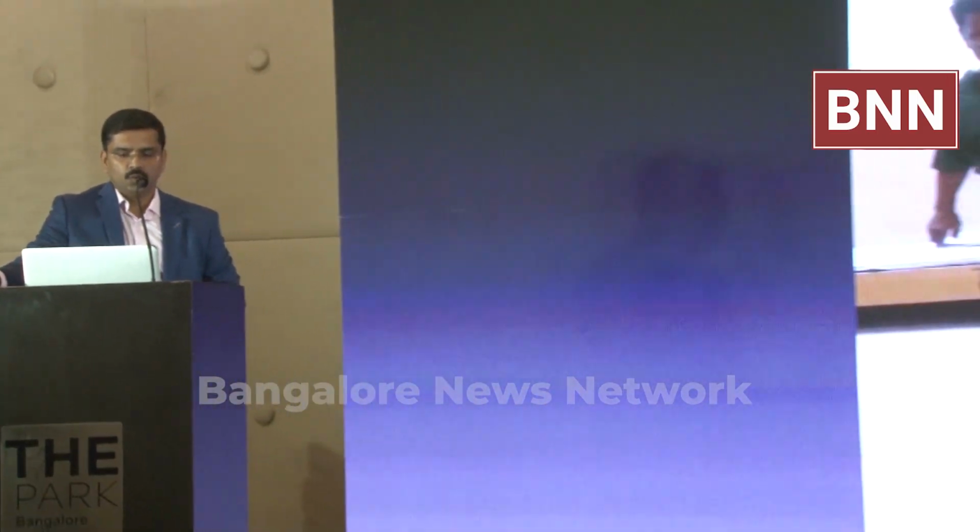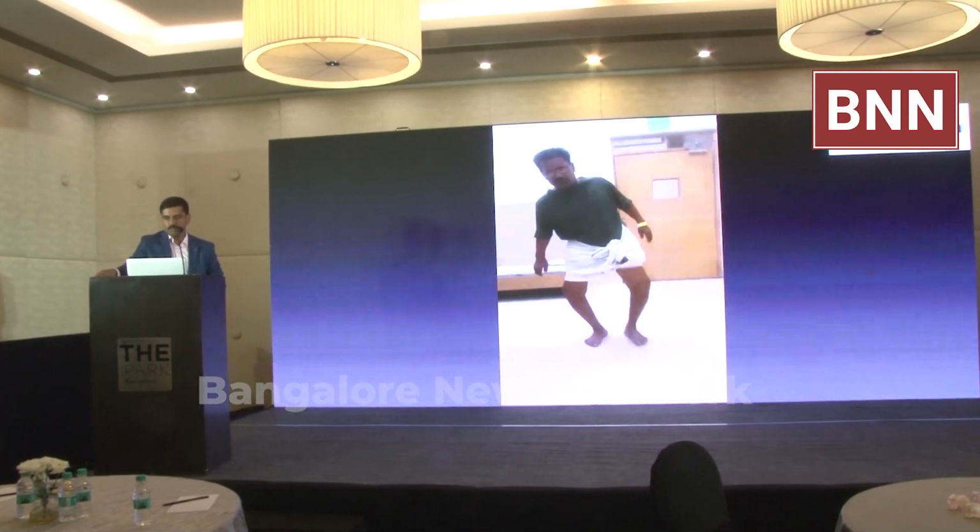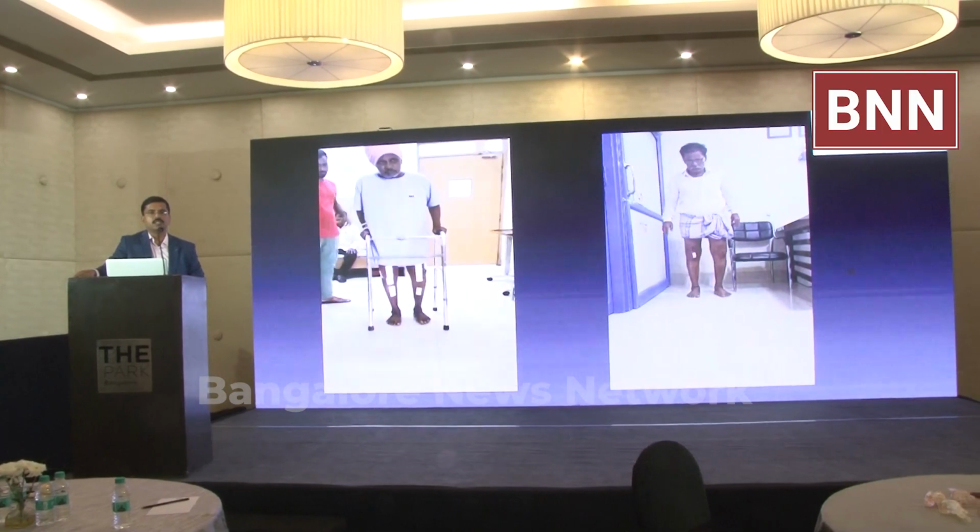Normally we have done plenty of surgeries like this with deformity, and we have corrected it. But in this patient, it is a compensatory deformity which is helping him to move on. So correcting this deformity completely would also give him problems. We had done many such surgeries in many patients, so we thought this could be an easy thing to do with the robot. So we tried to proceed with robotic surgery. Similar varus patients who had difficulty walking were comfortably corrected by our robotic surgeries.